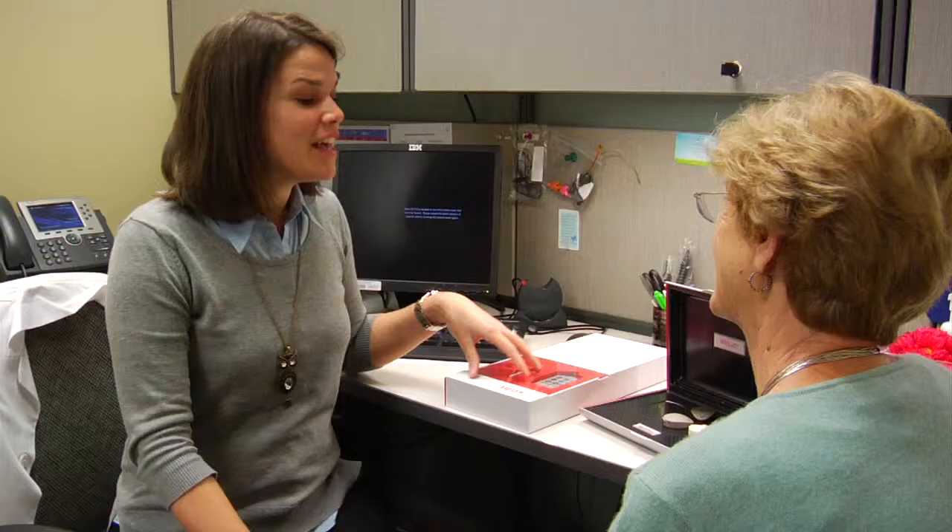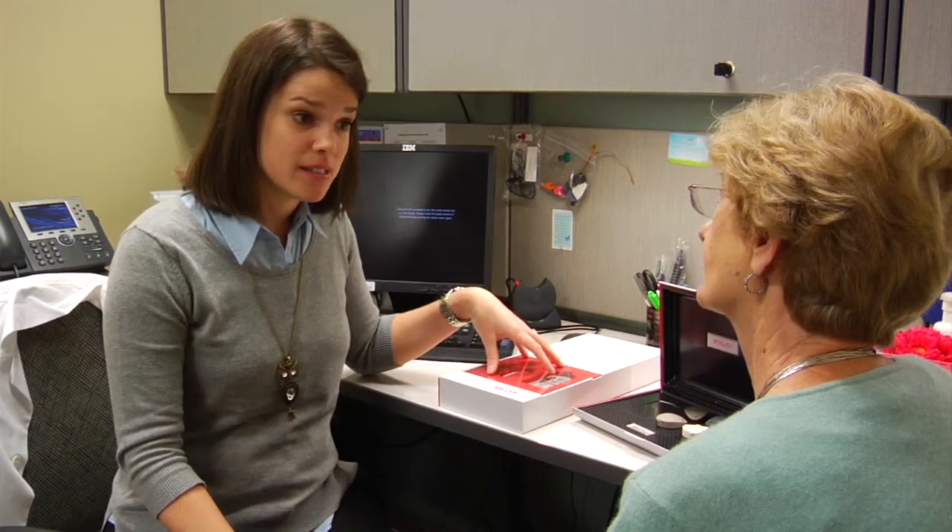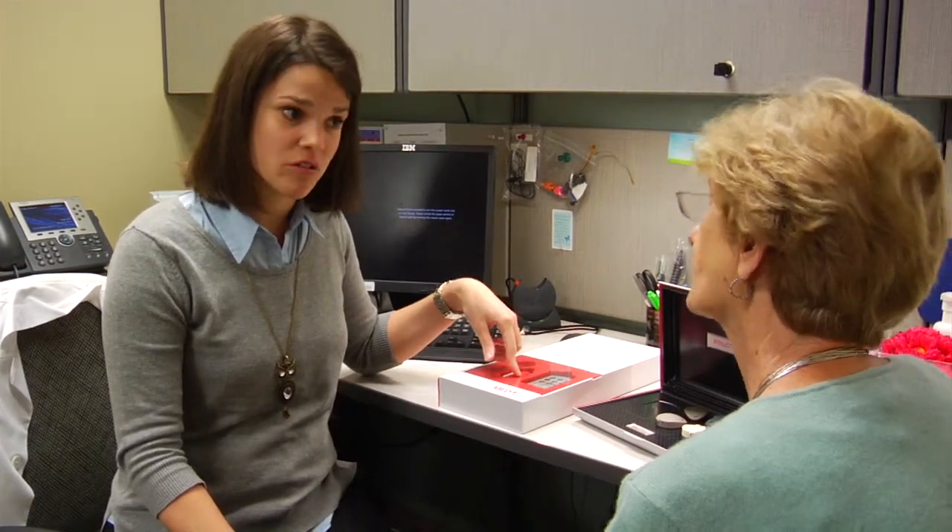When I finally had another test, it was explained to me that with a cochlear implant, the doctor explained he just goes in — he doesn't even have to shave any of the hair — which was not a big issue with me, but he was just explaining how easy it is. So let's talk a little bit about the process, and I'm going to show you the device, both the internal and the external.